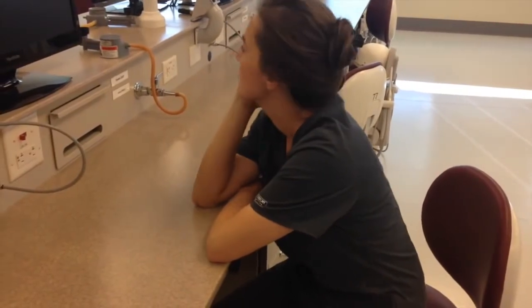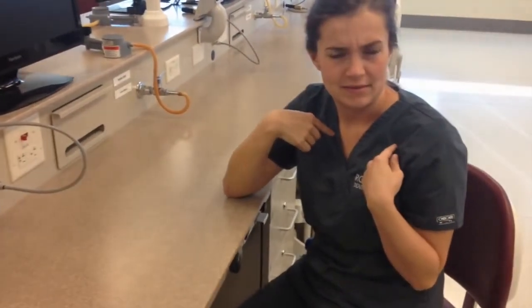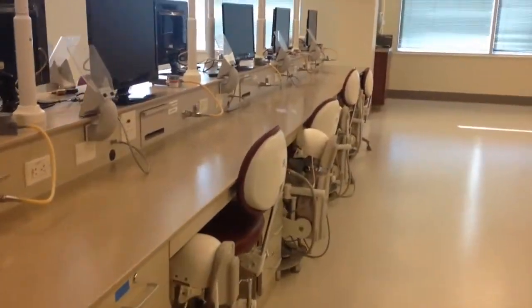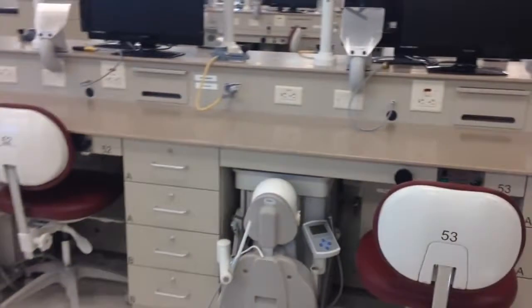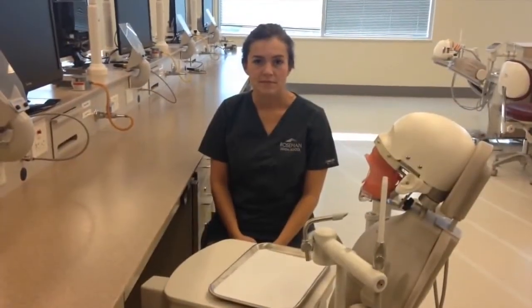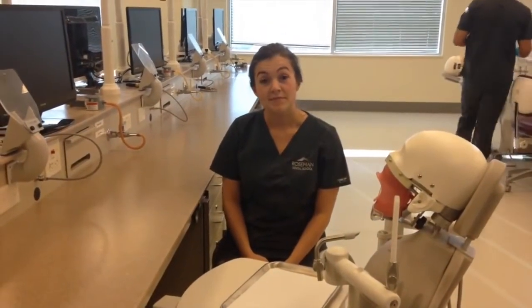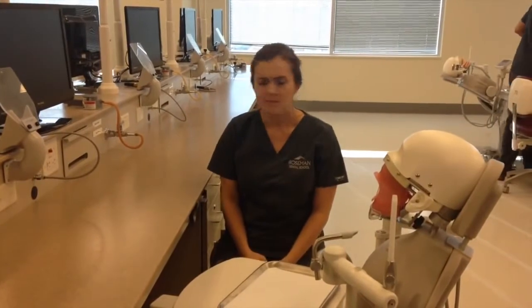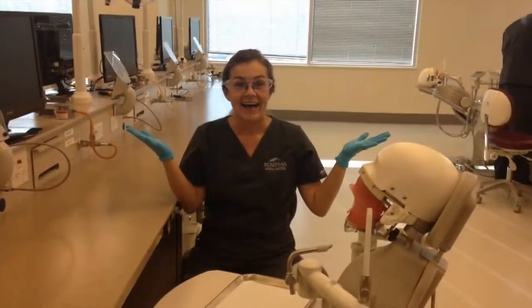Hey you! D1! Welcome! This immaculately clean wonderland is called the Sim Lab. It looks like you're almost ready to take some impressions. But first, you'll need the proper attire. That's better.